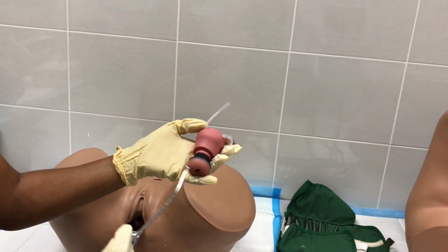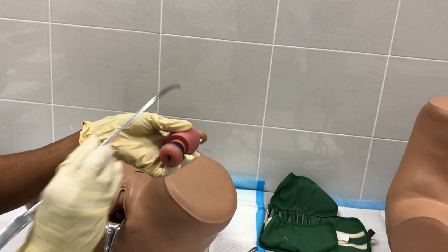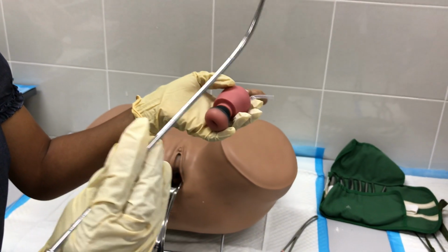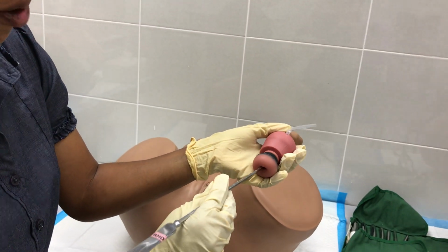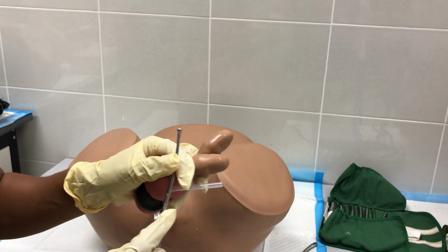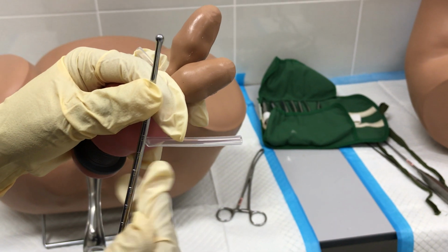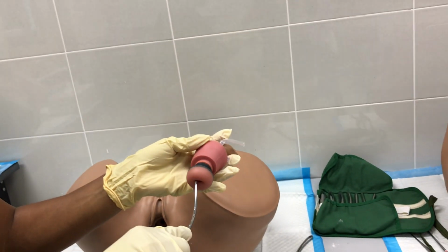If the uterus is retroverted, you have to use it the other way around, because the uterus will be moving backward. So you can use it this way. So that is how you introduce the sound inside. So you put it in. The moment you hit there, because you know already the uterus is about 8 weeks size, this is your finger here, number 7, number 8. So you have to put your finger around here at 8, so that you are not going to perforate the uterus. So you just put it inside.